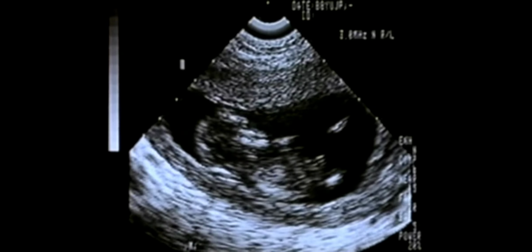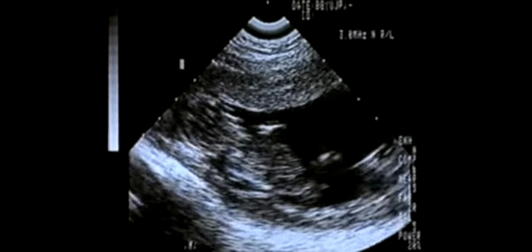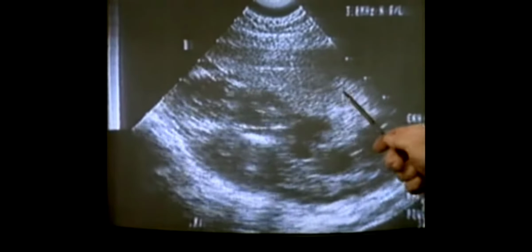Now, the heart has again perceptibly speeded up. We can time this at approximately 200 beats per minute, and there is no question this child senses the most mortal danger imaginable. The membrane has now been punctured, and the fluid has escaped. One no longer sees that large reservoir of fluid surrounding the child.